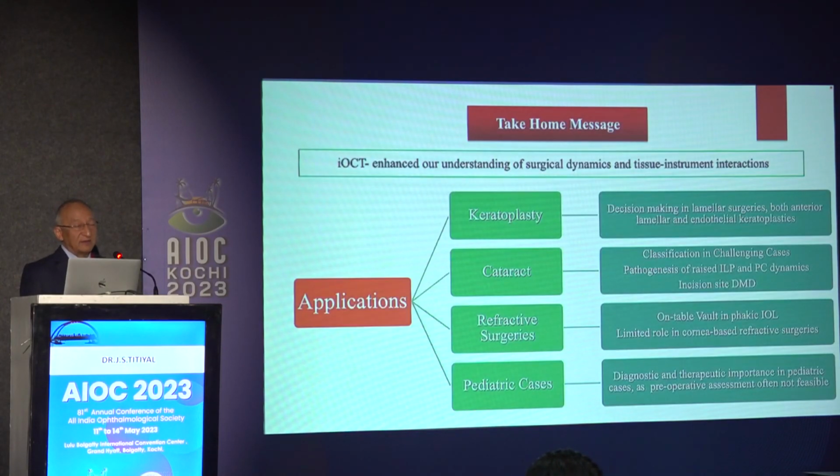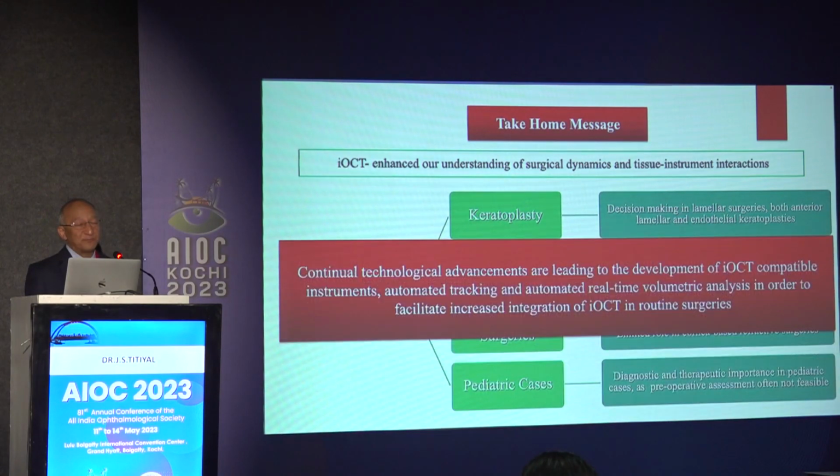So I can summarize, it has an application in all sorts of anterior segment surgery. Not only in cornea and cataract, it has application in pterygium surgery, ocular surface, squint surgery, every surgery; in glaucoma surgery, people are using IOCT now. And I can understand this is going to be a future tool, for every microscope to have an OCT attachment.